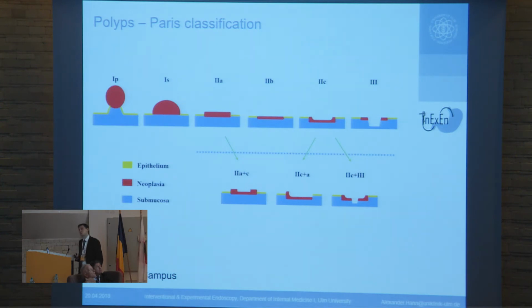So these were the first two projects. Then we were thinking of what we don't have. Usually surgeons, when they do laparoscopy, have two cameras in front, so they have a stereoscopic view. But we have only one camera, and except for Olympus, who published a study right now with two cameras in front of a gastroscope, there are usually no two cameras built into our endoscopes.